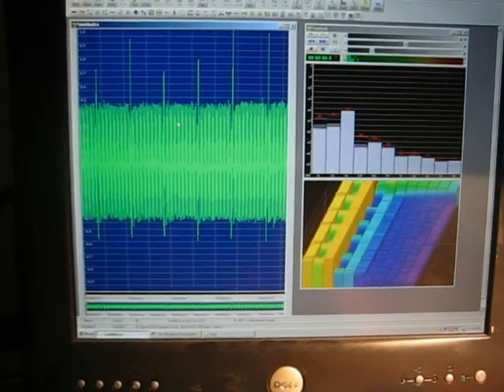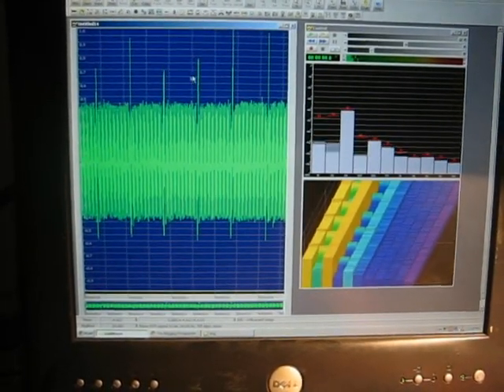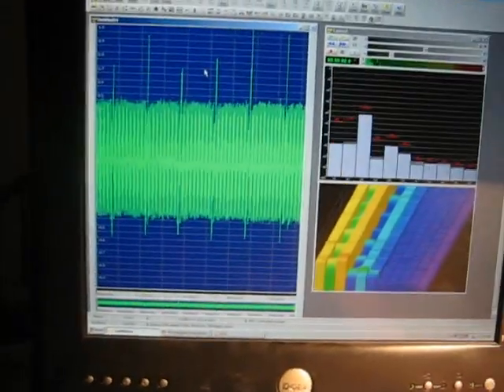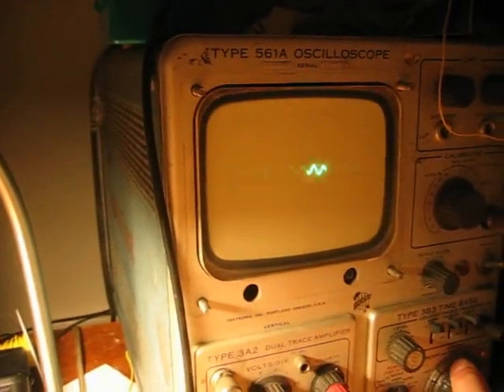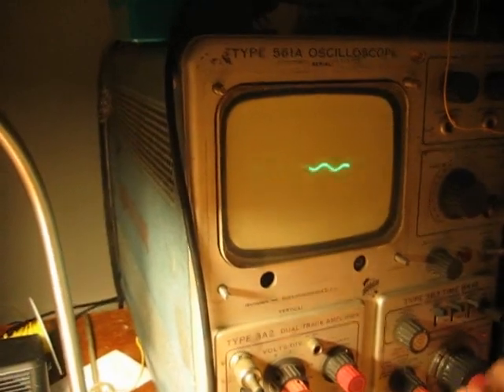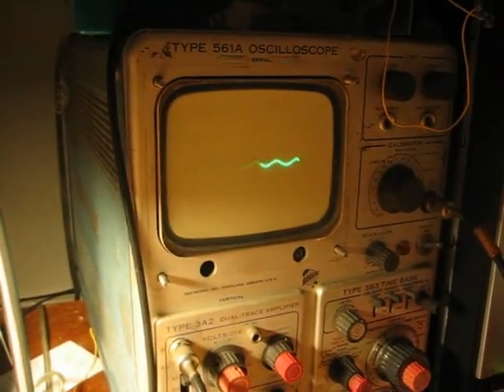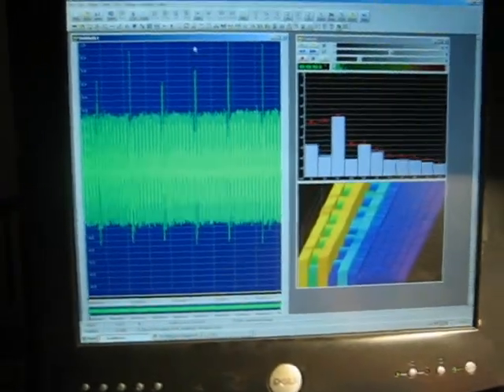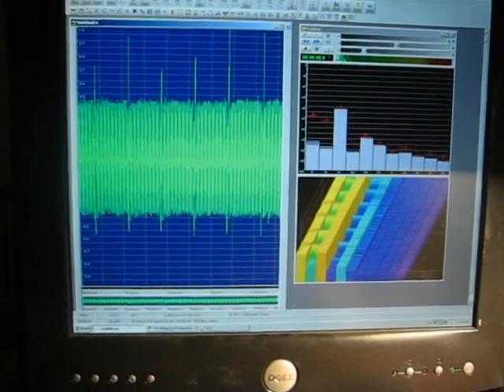And you can see there's a lot of electrical noise in here. These heartbeats aren't very clear. We've got all this vertical noise. And you can actually see that noise if we turn up the speed here. You see those little sine waves? Make it a little bit faster. That corresponds to the electrical noise coming from my walls from the alternating current. Alternating current in most homes occurs at 60 Hertz, so we've got a lot of 60 Hertz noise in here.